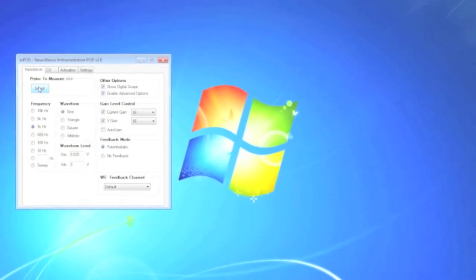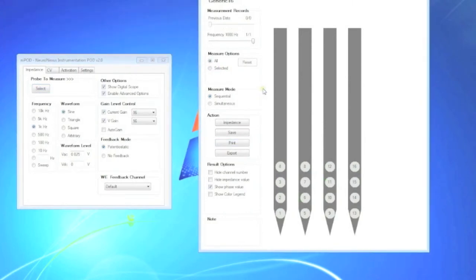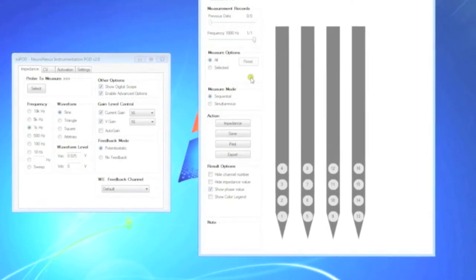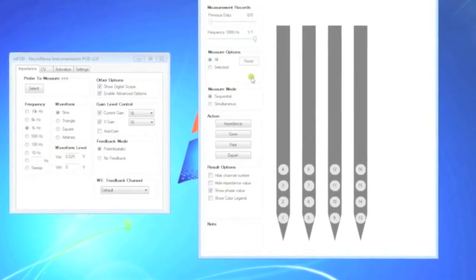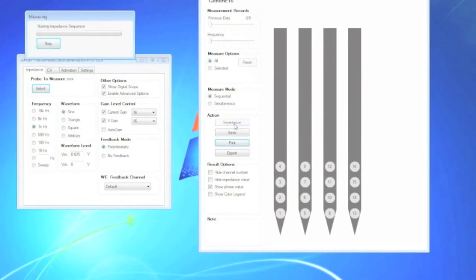For an impedance scan, you can select only the sites you want to measure, or measure all the sites, in either simultaneous or sequential mode. We recommend measurements in sequential mode, as while simultaneous mode is quicker, it may be less accurate. Press the impedance button to run the scan.